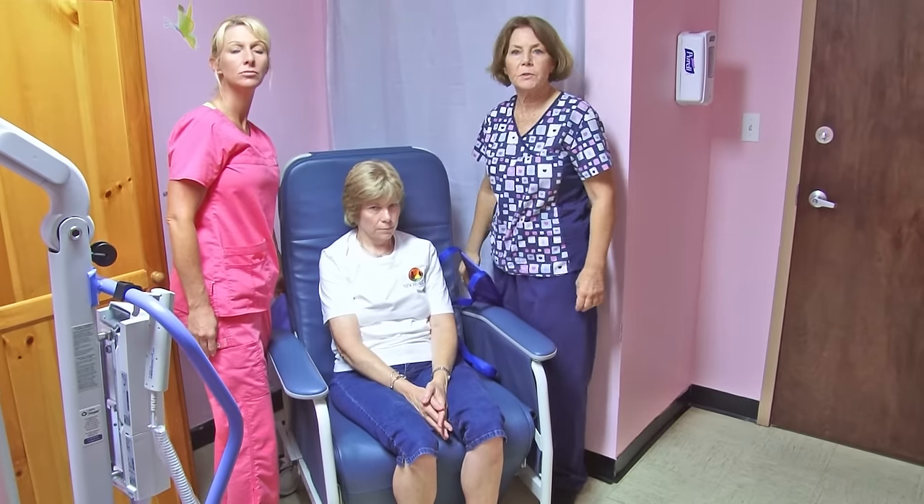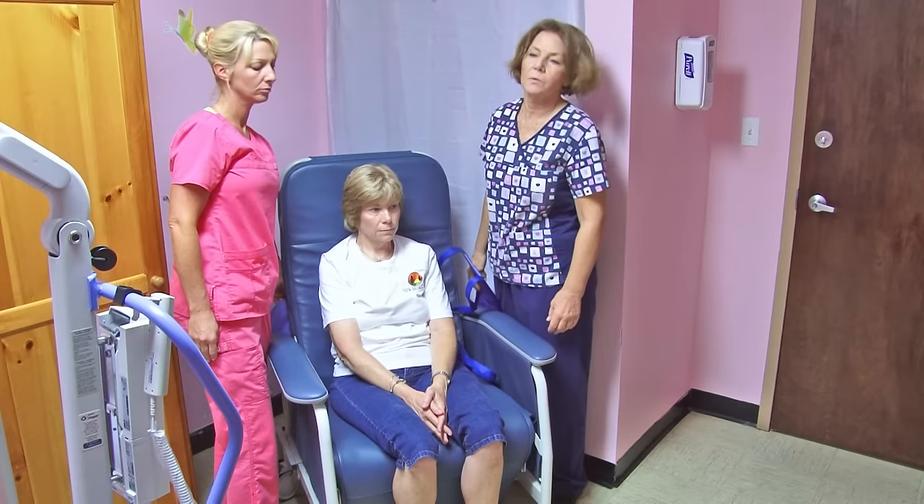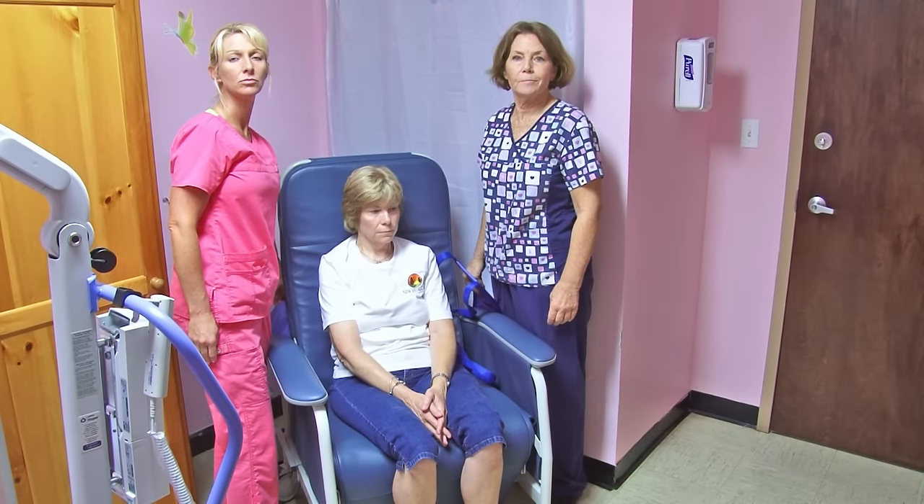And there you have your patient or resident moved to a sitting position. Thank you. So good.